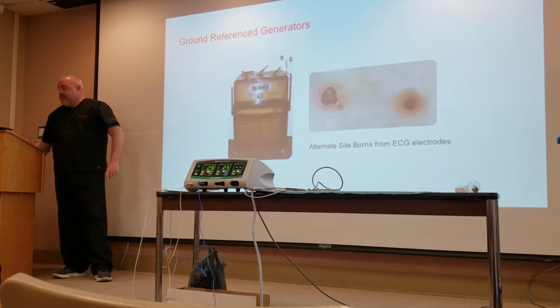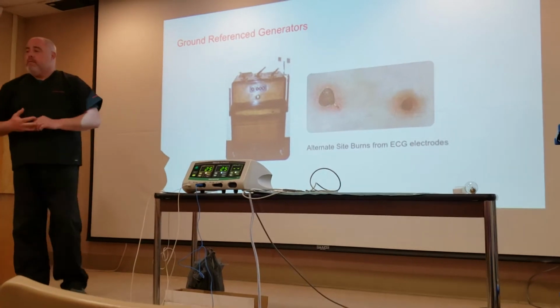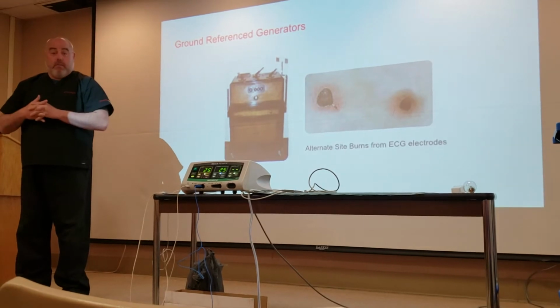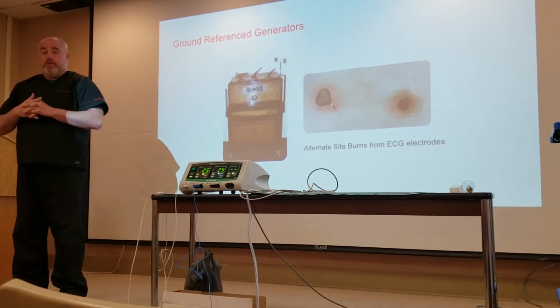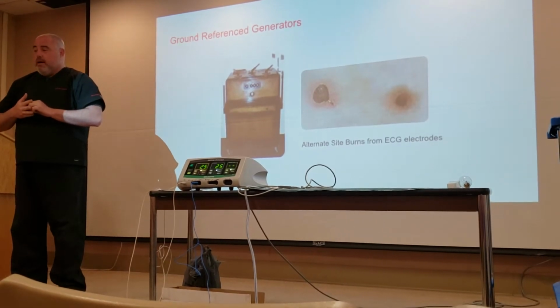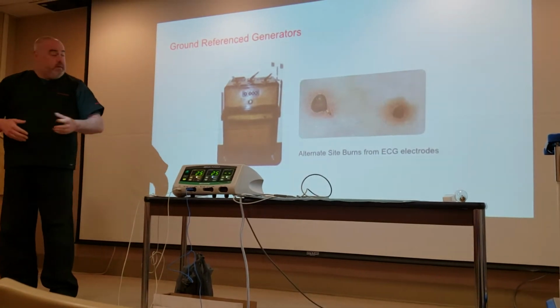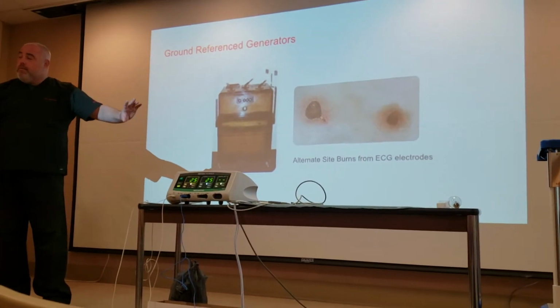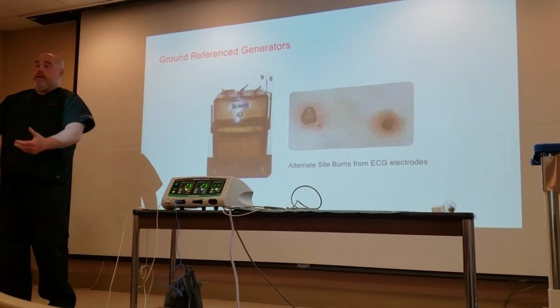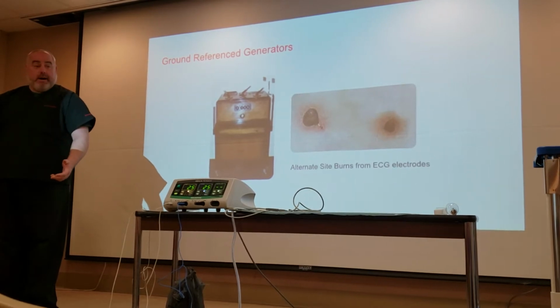We've had two types of generators. Anyone seen a ground reference generator? We shouldn't see them anymore. I think they still get used. They probably get used overseas. But these were the original generators. A big problem. We call it a grounding pad because of this concept. These generators were grounded to the floor. So if you did come in contact or something like that, you got some shock.